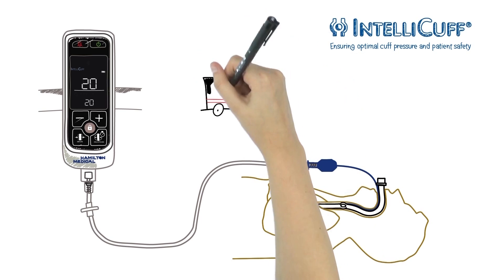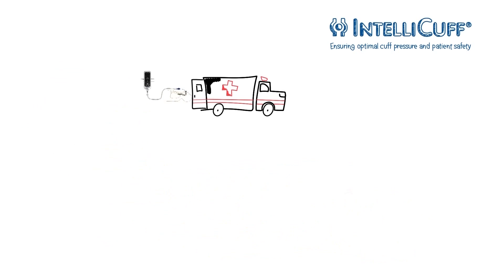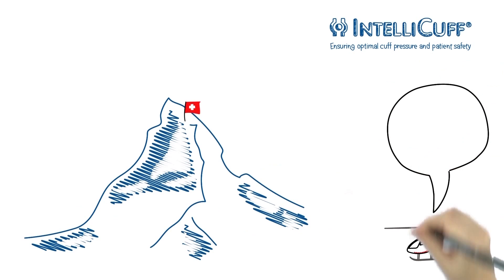The Hamilton Medical IntelliCuff pressure controller is prepared for every situation. It secures airway management in intensive care units, operating rooms, and during transport. You can use the device during air transport, even at higher altitudes.